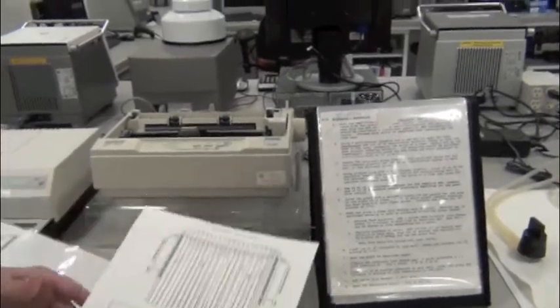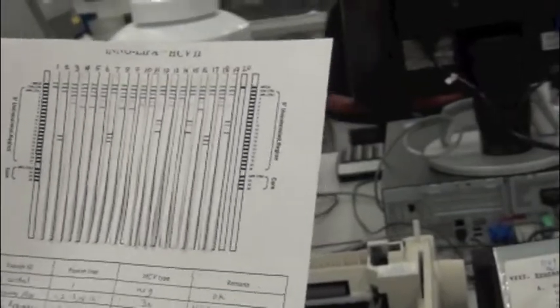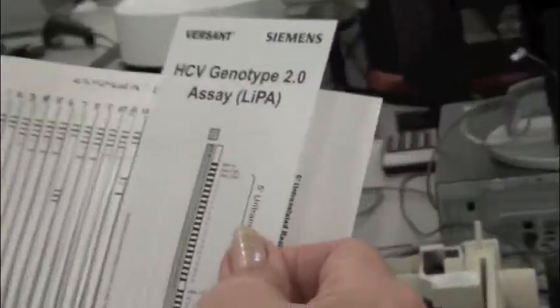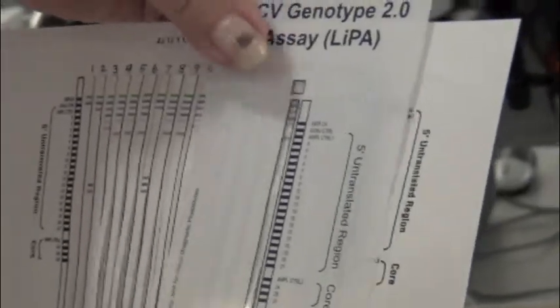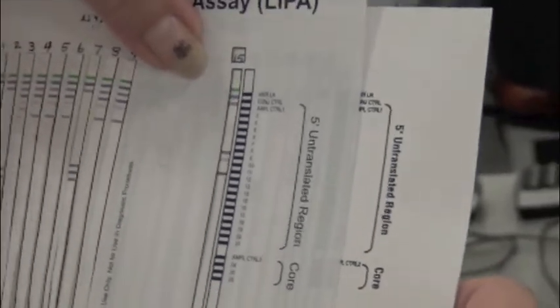We take them out of the glossy area there. On these sheets that we mount them on, they do actually have the numbers here, and they're a little blurry and hard to read from being Xeroxed so many times. So it's easy to set this over the top of one, and you can see here's where this is a bit different. You can see here the strip number 15 on top. You've got the marker line, that green line at the top there.